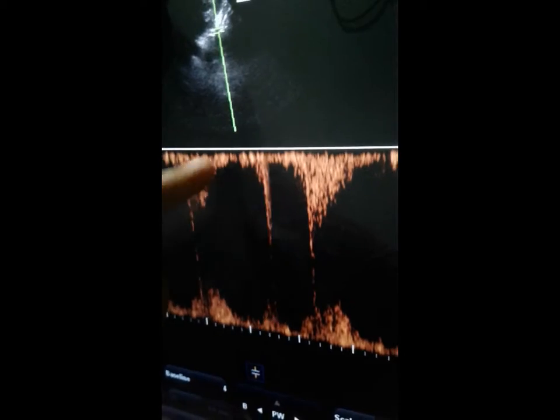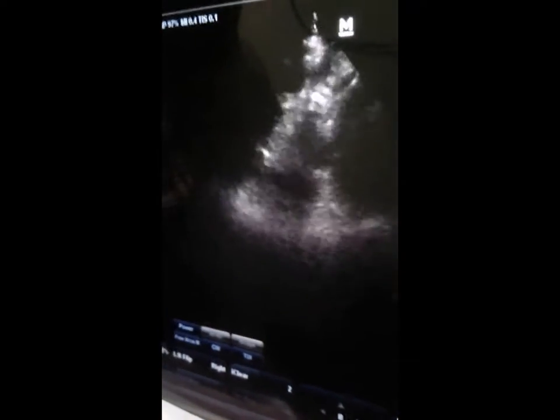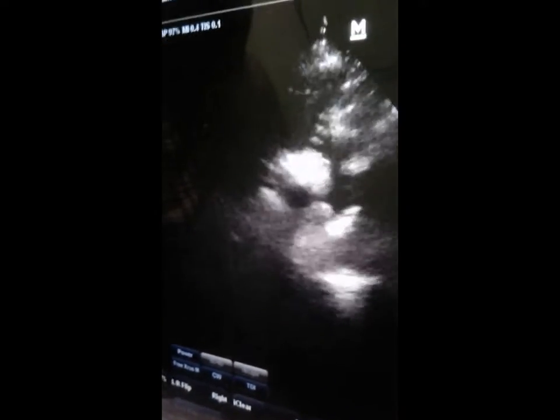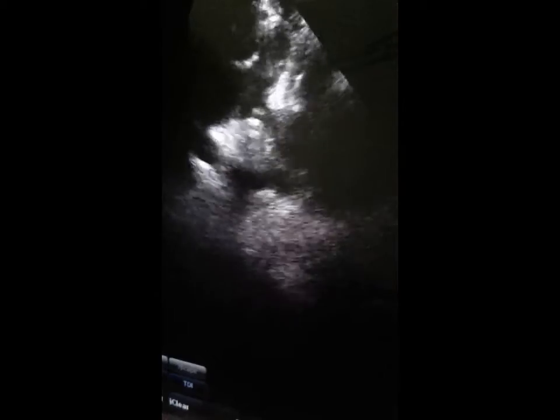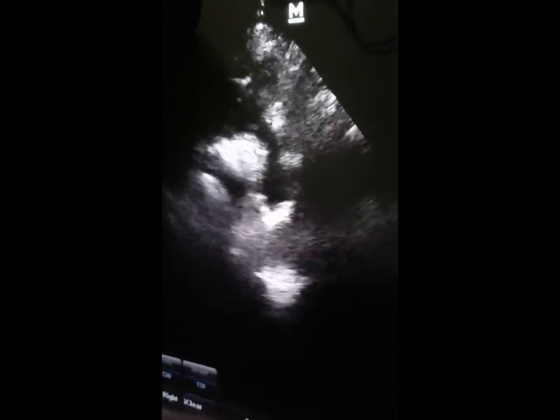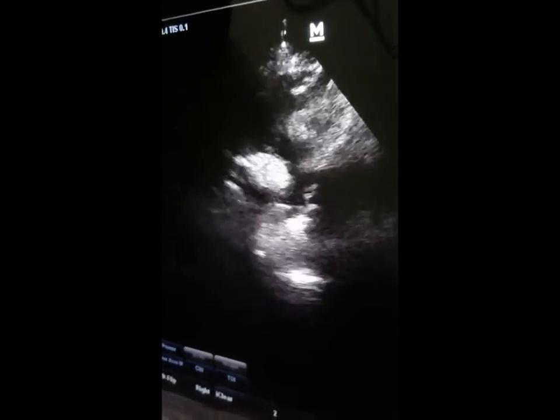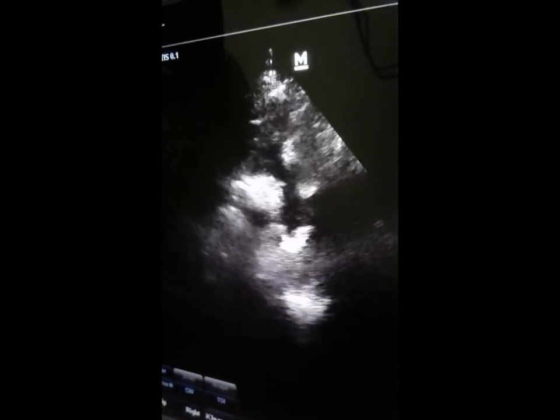This is the coarctation, which is associated with high blood pressure. It needs further evaluation by MRA. Thank you for listening.